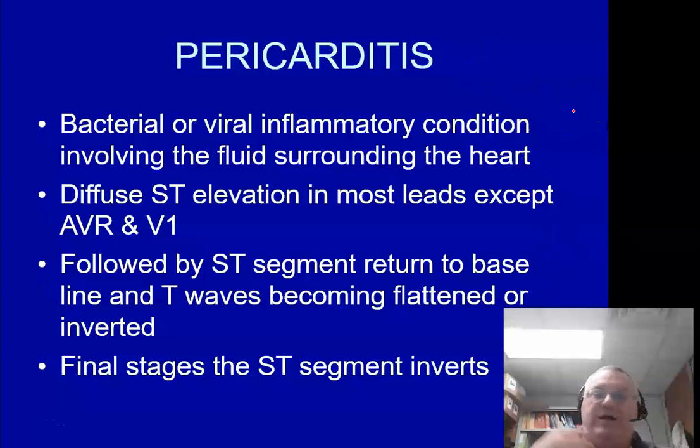Pericarditis, and I'm very sorry, I've got a slide somewhere, I can't find it, and good Lord, I've tried to find it. I will have it by the time we get to class, because it will be quite obvious, okay? There is going to be diffuse elevation in most leads except for AVR and V1. But the rest of them are going to have elevation. So if I've got 9 or more leads with ST elevation, more than likely I've got pericarditis, okay?